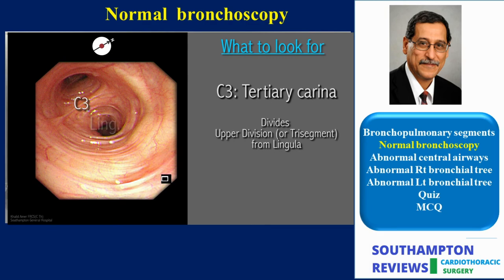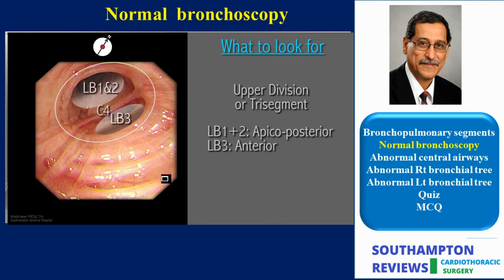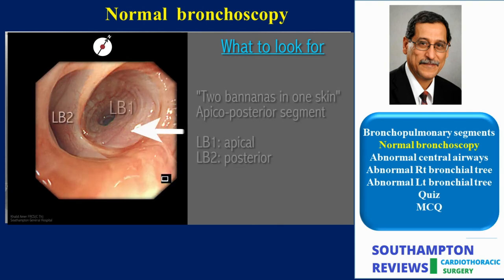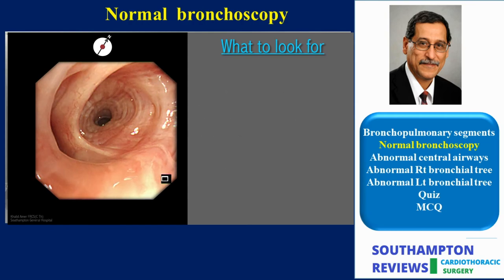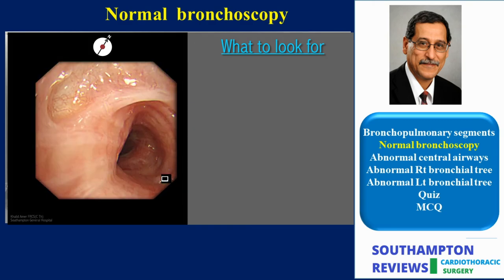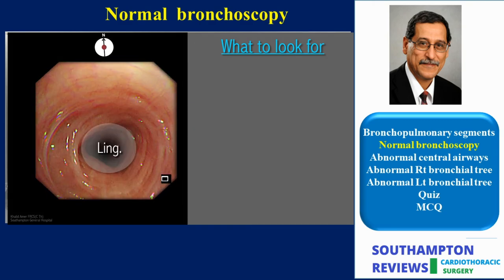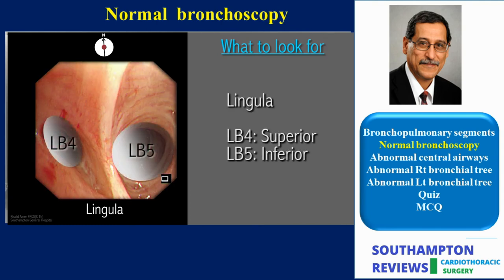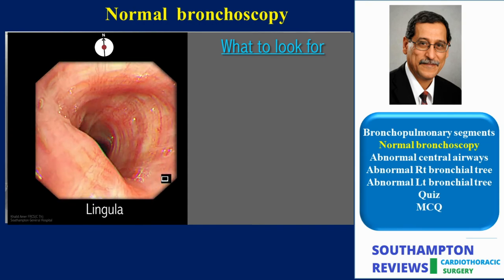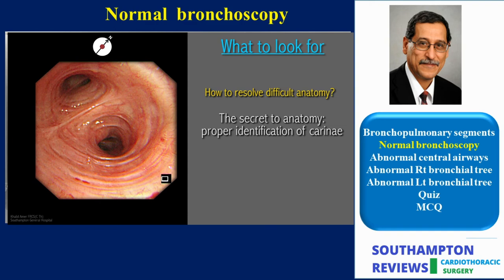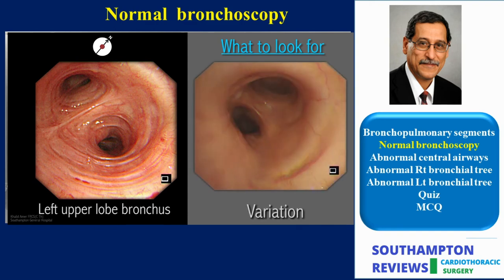On advancing the scope into the upper division, we again look for the quaternary carina, which divides the apico-posterior segmental bronchus Lb1+2 and the anterior segmental bronchus Lb3. The scope is then introduced into the lingula to expose the two segmental divisions: the superior Lb4 and the inferior Lb5. Before examining the lower lobe, let us examine some variation of the left upper lobe. This is a good example of how carina recognition plays a crucial part in resolving confusion.